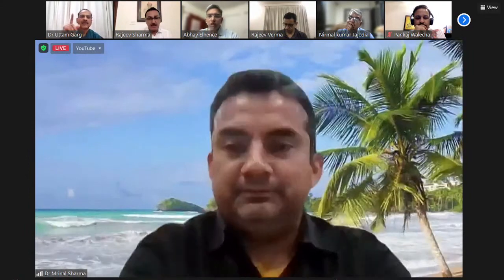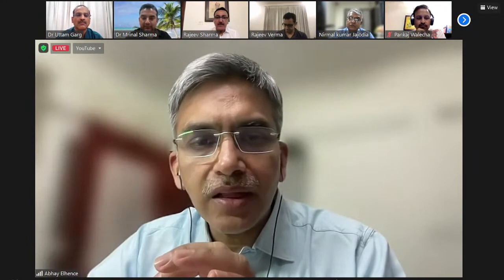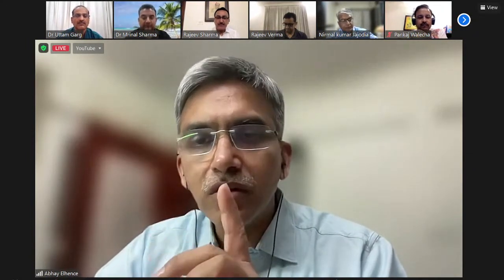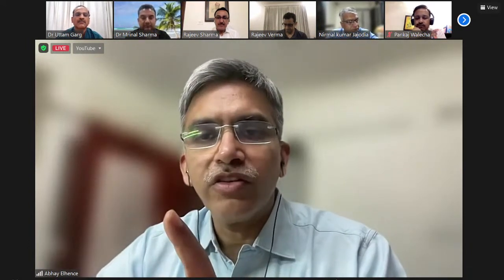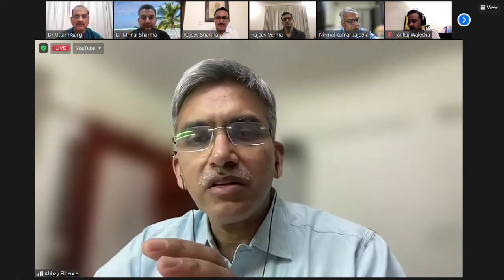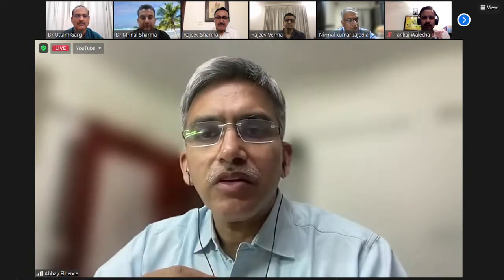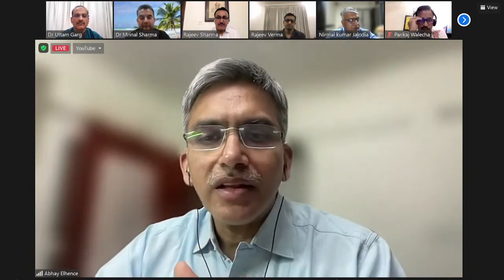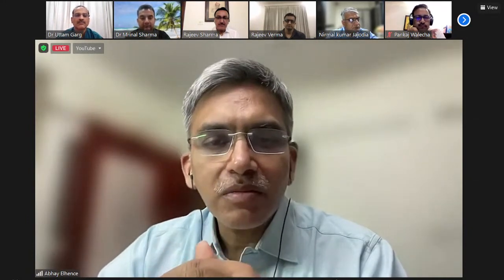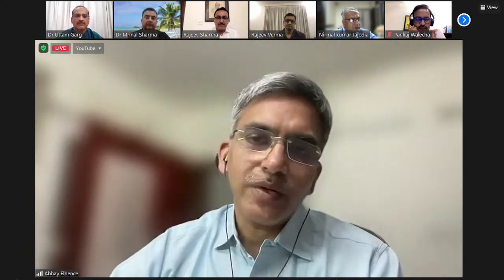Sure. Yes, Brunal, you were saying something. One thought process on these situations is that we need to look at them as we look at the revision scenario. So when you feel your zone one fixation is not going to be enough, you add fixation. And in today's times, we have good enough implants where the keel has a good length for us not to worry too much. So if you're adding a stem, then you're probably looking at an additional zone two fixation, and then you just need to do a hybrid cementation and just cement the proximal part so that you prevent proximal stress shielding as well. You're right.